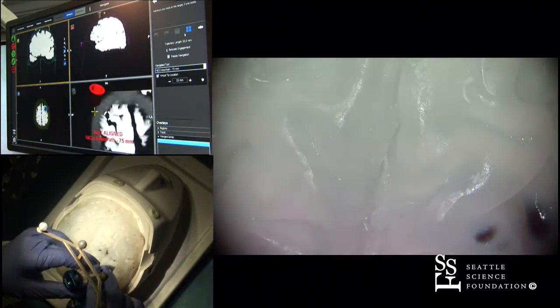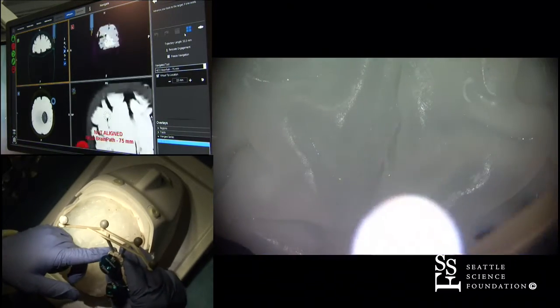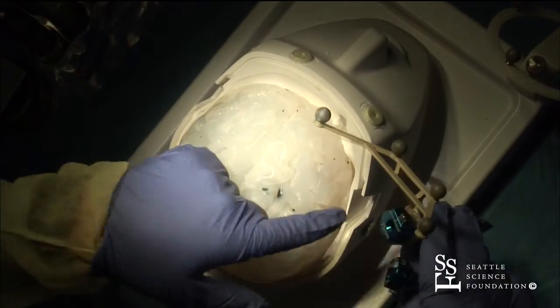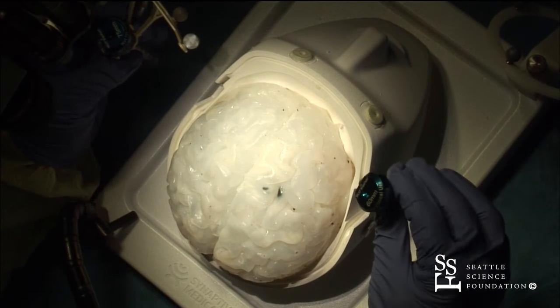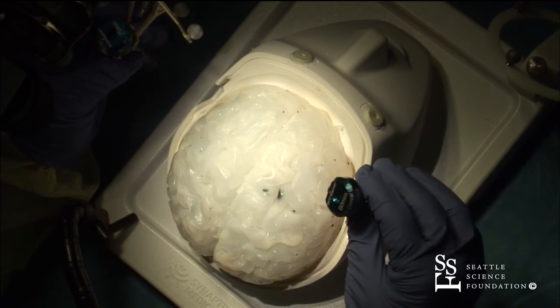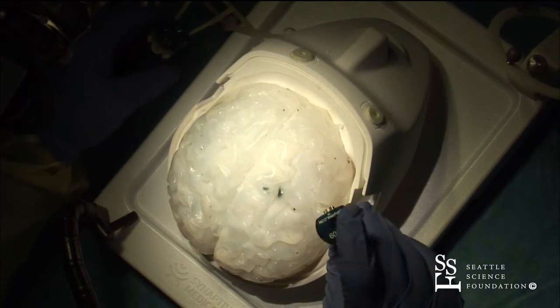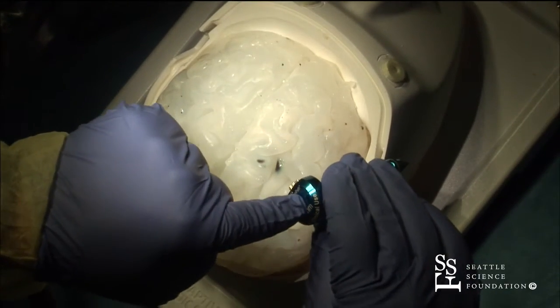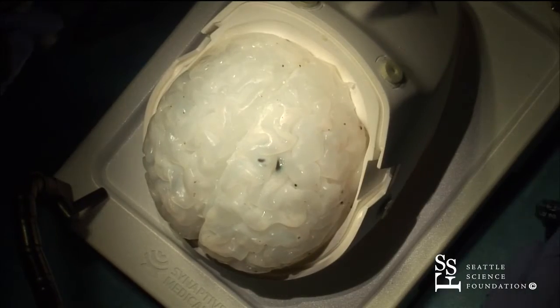There are different ways that this is done. If you have the Synaptive Image Guidance platform, then you have an attachment to the tube. Whereas if you're using Stealth or Stryker or whatever, then you see that there's a central hole tube in the obturator, so your image guidance probe goes inside of this and then you're using that to drive your port.